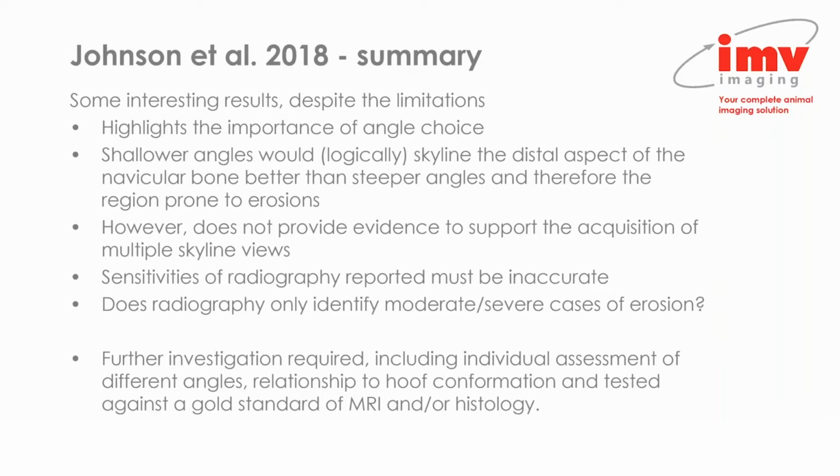So further investigation is certainly required, including an individual assessment of different angles rather than multiple versus one view, but also relating this to hoof conformation and also testing against a gold standard of either MRI and/or histology or gross pathology. This would be much more appropriate and would be absolutely required before we can make any strong conclusions based on whether two views are better than one.